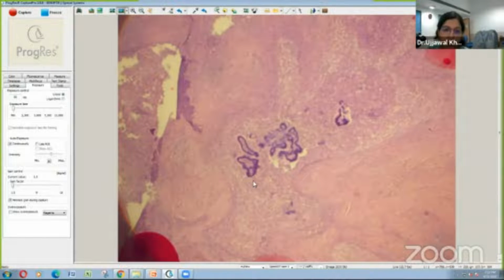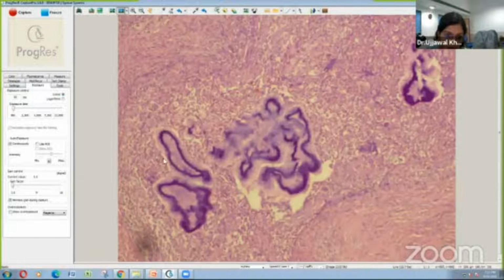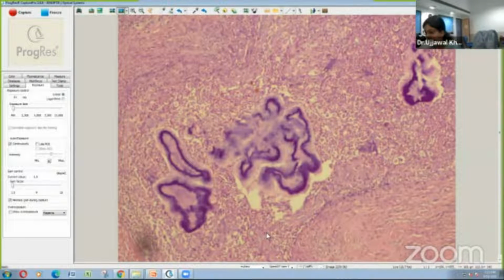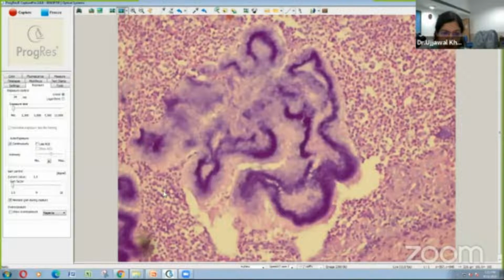And the color of the grains can also give us a clue, because the grains of actinomyces are never black in color, whereas the grains of eumycetoma can vary in color from black to white.